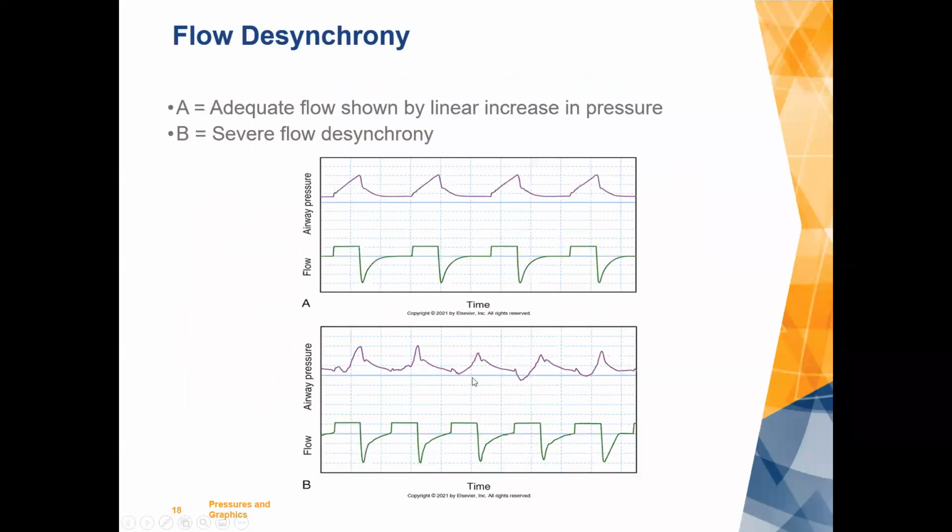So, flow desynchrony. What I do want to say about desynchrony in general is there are many causes, and I have one of my subsequent slides here where I show you other causes than simply flow desynchrony.